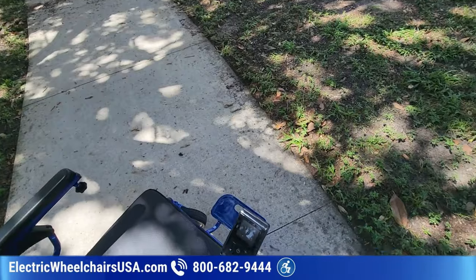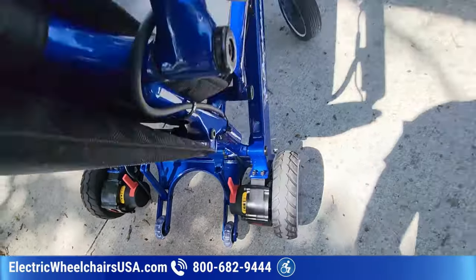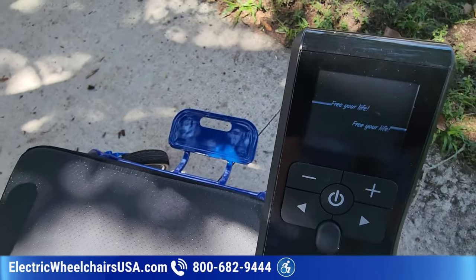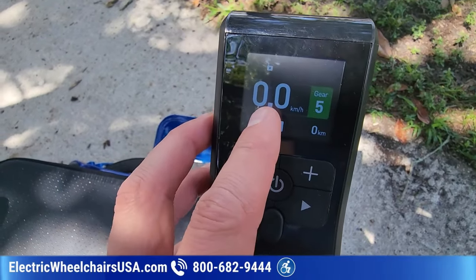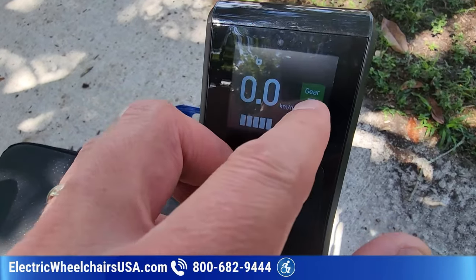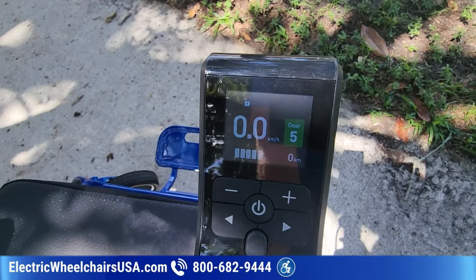I'll go over some of these buttons on the joystick. I'm going to put this back in the drive position first before I turn this on. So if I power this on, we have our speedometer, which is in kilometers per hour. The top speed on this is 4.5 miles per hour. You can see it says gear 5. That means that's the top speed that this is set on. So 5 is the top speed, 1's the lowest.